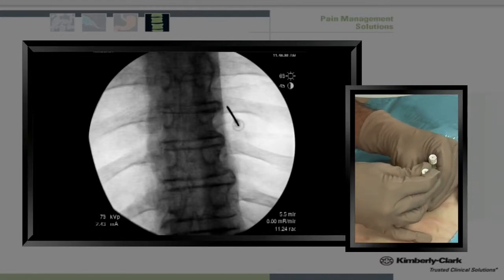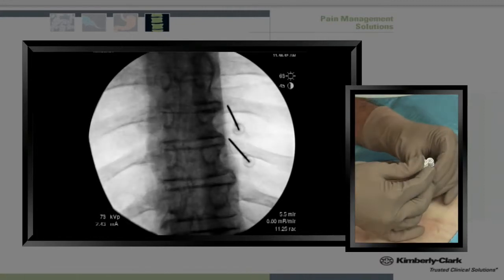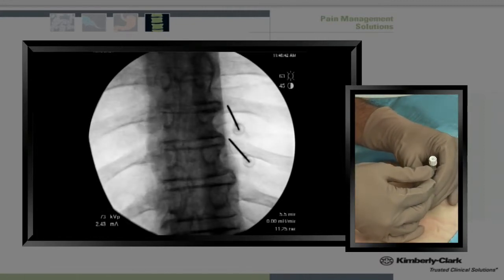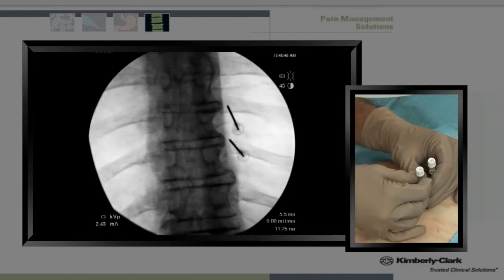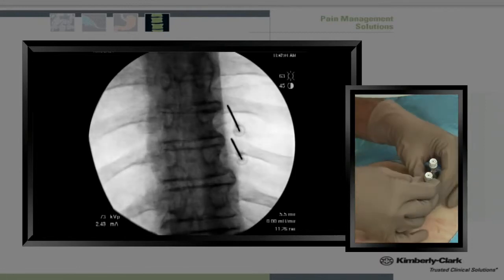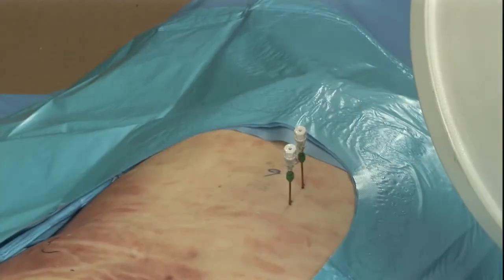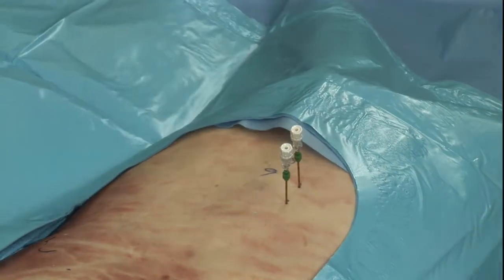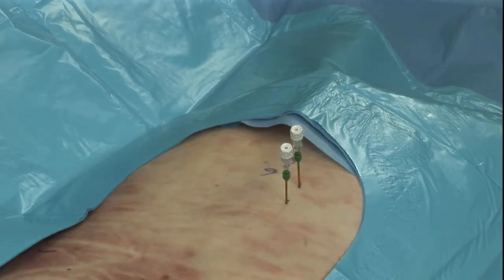Again, using a slightly inferior approach so that I can continue to use the bone of the transverse process as a safe bony backstop. Once I've placed the needles and I have bony contact, I move to a lateral view. This view can be used to ensure that you're not too deep and also to confirm appropriate placement.